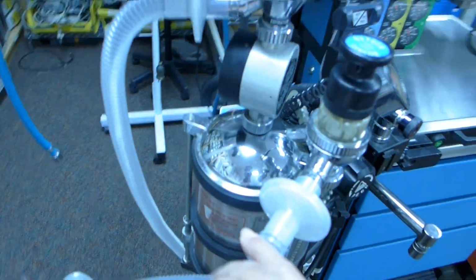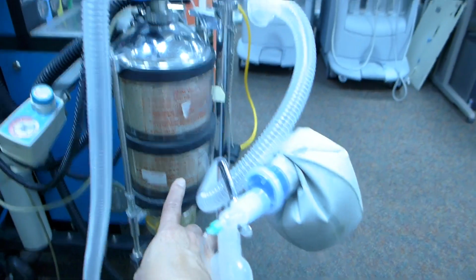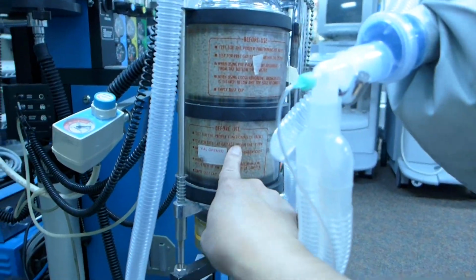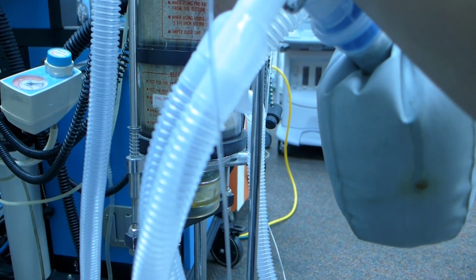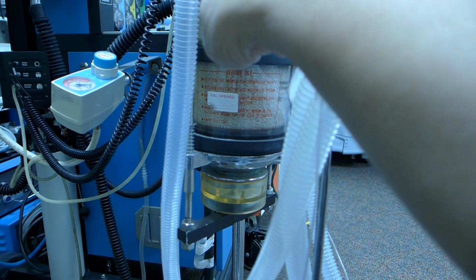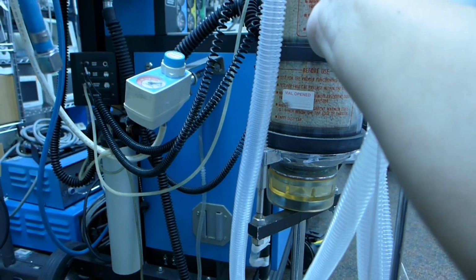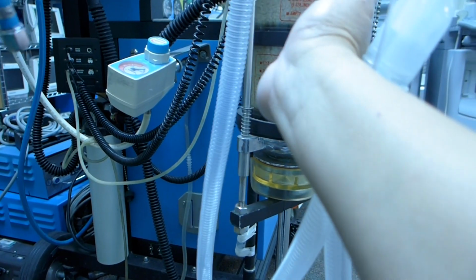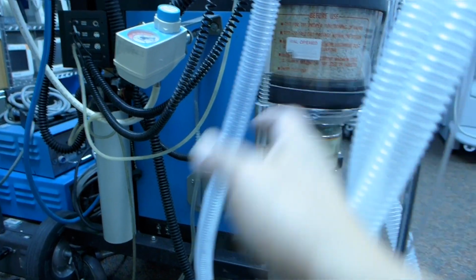And here we have what we call the soda lime. The soda lime here absorbs the CO2. So basically from the top it's going to turn purple first, and when it's about halfway purple, we replace it. Basically what we do is toss the top one, move the bottom one to the top, and put the fresh one down here.